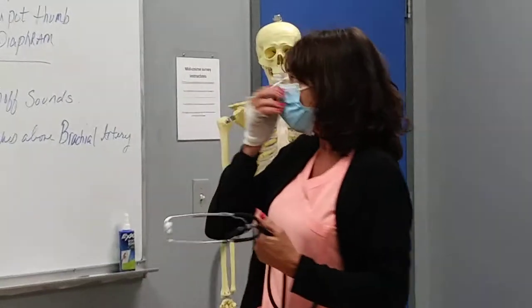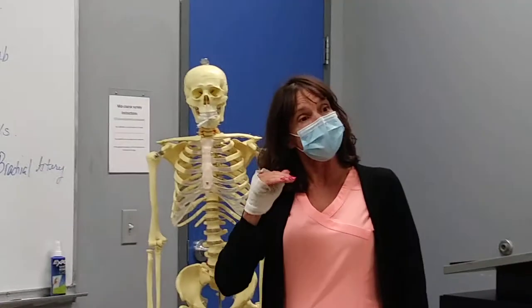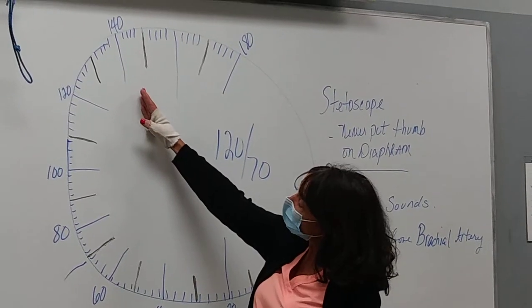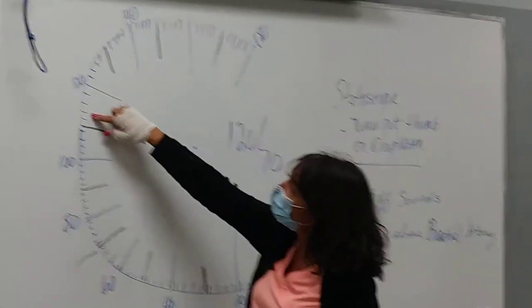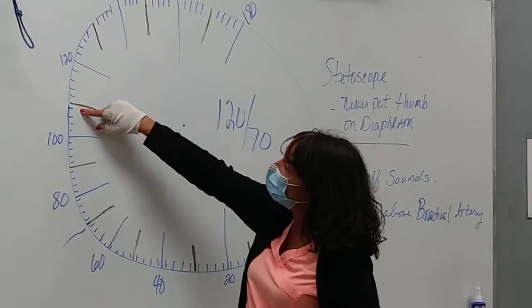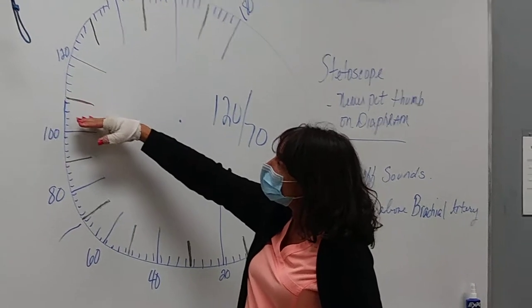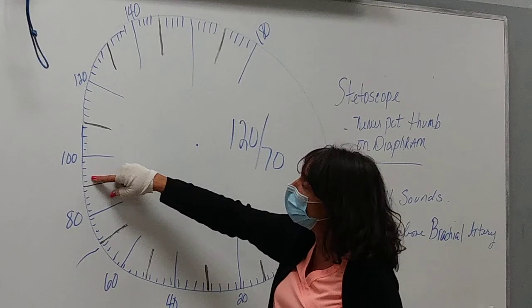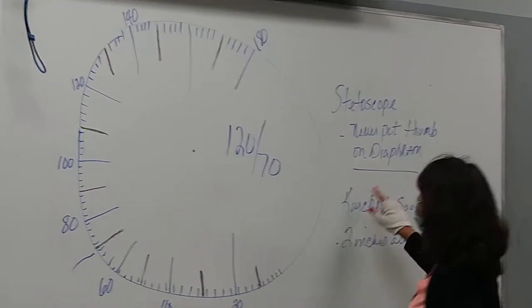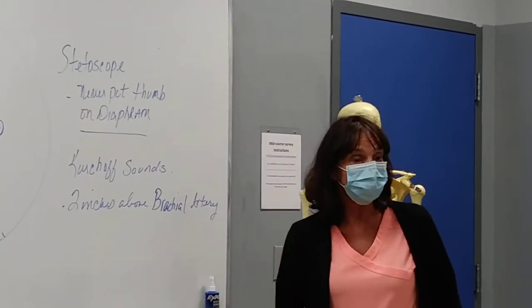All right? What you're going to hear as you pump up is the Korotkoff sounds. And it's got to stay consistent. So let's say you pump up to 140 and you let your needle fall. You're going to hear quiet, quiet, quiet, and all of a sudden you're going to hear ba-boom, ba-boom, ba-boom. You hear nothing, it keeps continuing to fall, and then ba-boom, ba-boom, ba-boom. The Korotkoff sounds are completely consistent, so you know that is an accurate blood pressure.